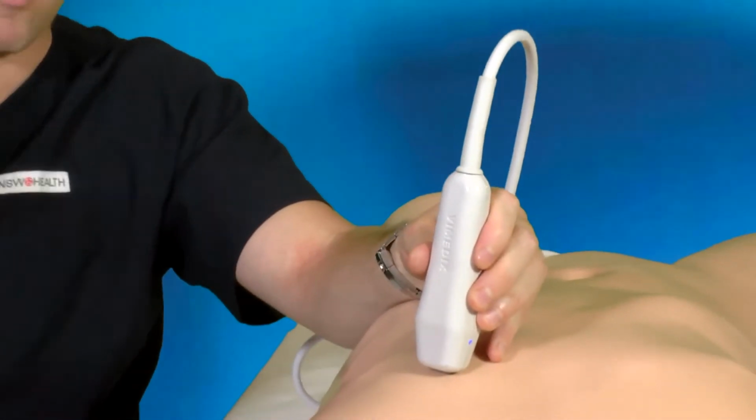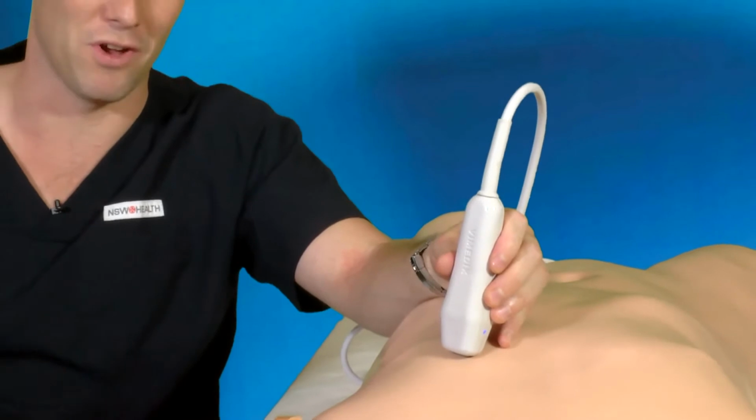And remember, we have a complex three-dimensional structure which we are imaging with a two-dimensional imaging tool, which means that we must assess it at as many different angles as possible, and we have to angle all the way through the structure to get an idea of the motion.